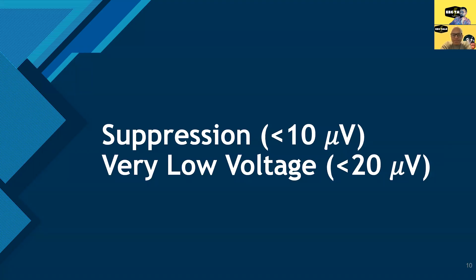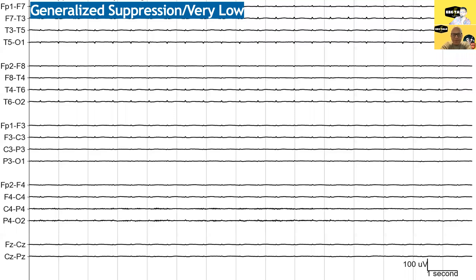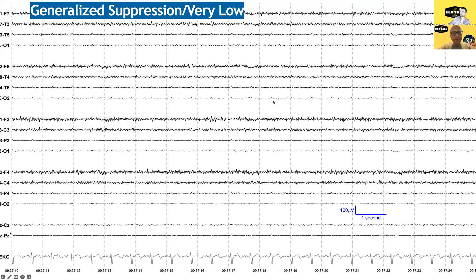Getting flatter now — this is suppression, or looking at it purely by amplitude, it's very low voltage, being less than 20 microvolts. These two terminologies begin to clash, but we should go with the suppression term — so this is generalized suppression, and it's also very low voltage. You can see the ECG artifact here, and when it's very low voltage, the ECG artifact looks really small.